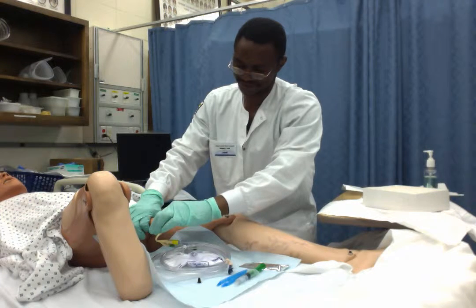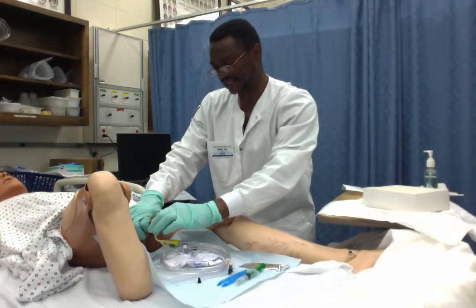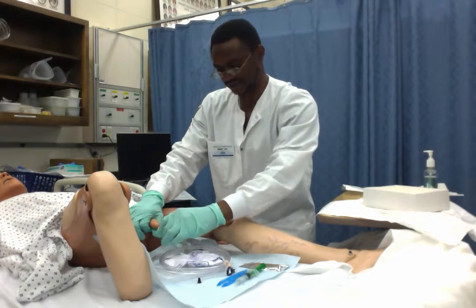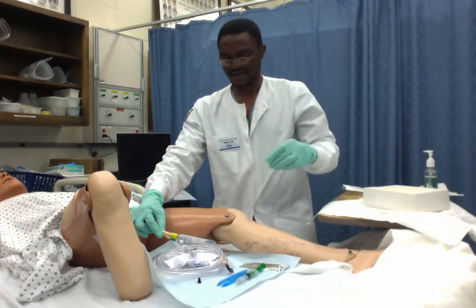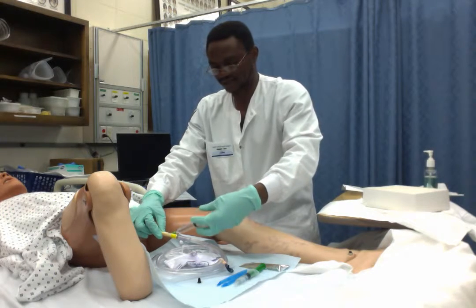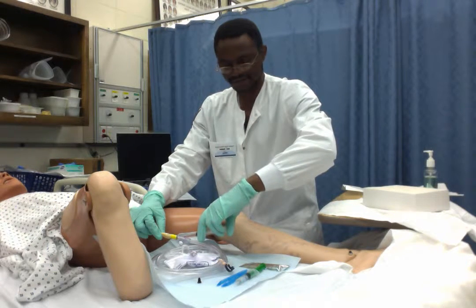If I should encounter resistance, I will pull it back, try to turn it a little bit, and insert it again. If the resistance persists, I might stop the procedure and report to the doctor. I will now use my liquid to inflate the balloon. I will inject all of the 10 milliliters of water into the balloon.